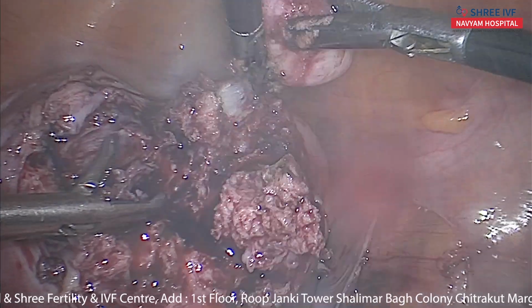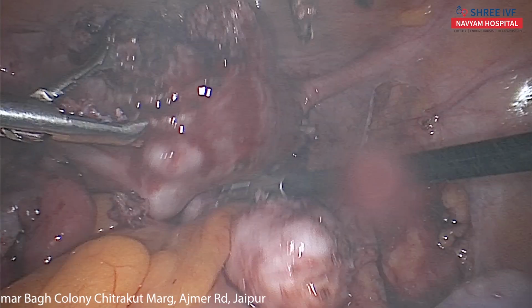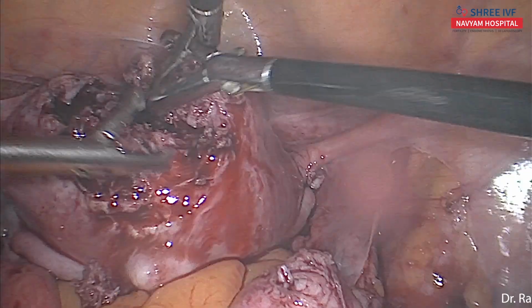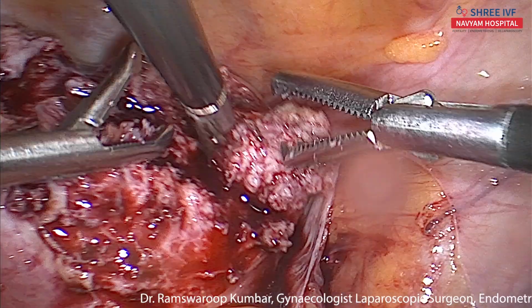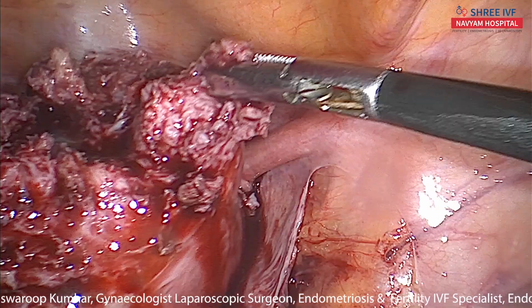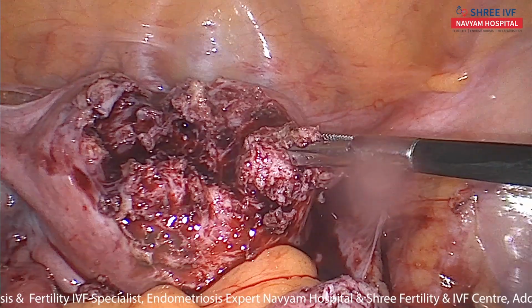Okay. This is myoma number 3 is out. This is a smaller myoma. Tenaculum.